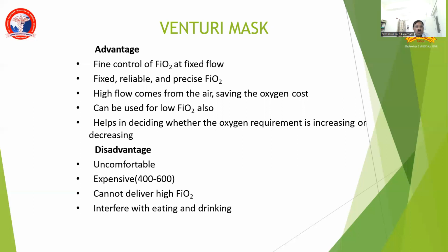It can be used for the low FiO2 also. It helps in deciding whether the oxygen requirement is increasing or decreasing. So advantages: fine control of the FiO2, reliable supplementation of the FiO2, high flow comes from the air, reduces oxygen cost, and helps in deciding whether oxygen requirement is increasing or decreasing.